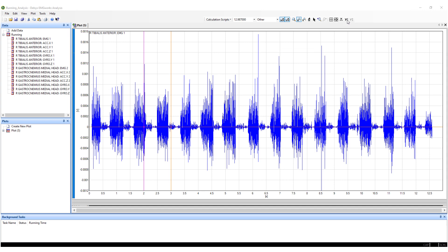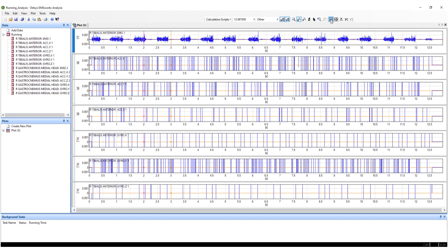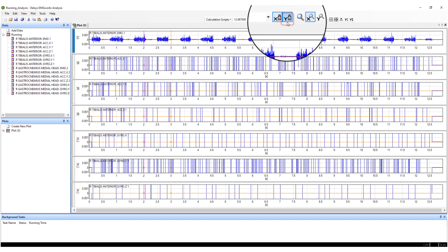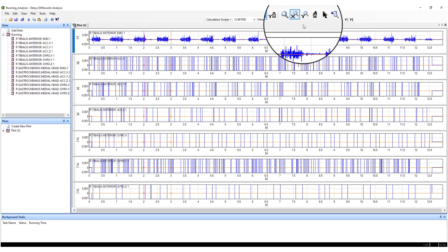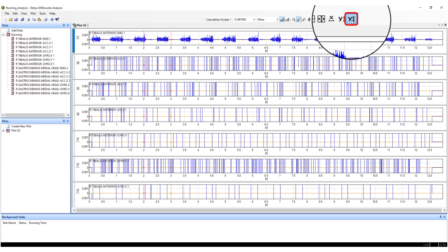To collapse the window, select the Equal Size icon from the toolbar. When working with multiple data sources of different units, it may be useful to scale each plot accordingly to best fit the data. This can be achieved by deselecting the Y-lock icon from the toolbar and selecting the Auto Y-All icon.